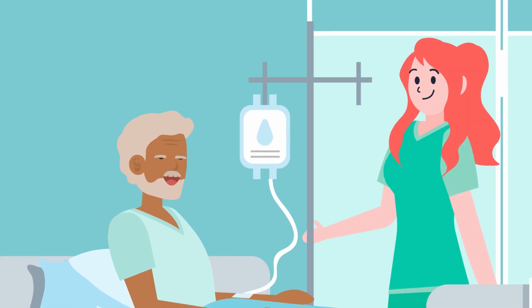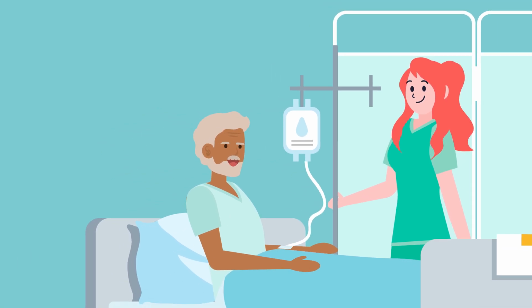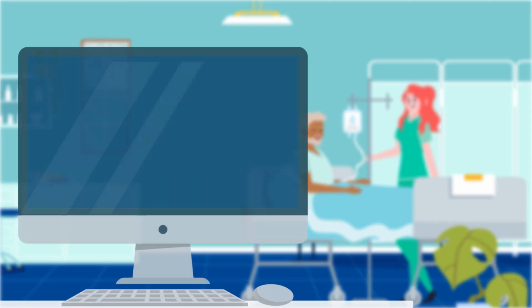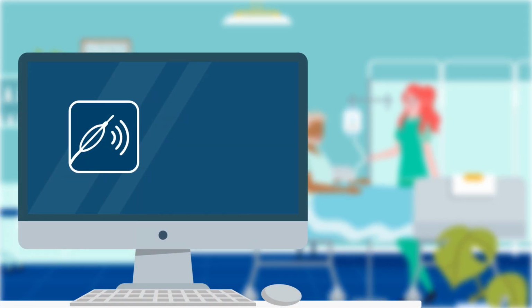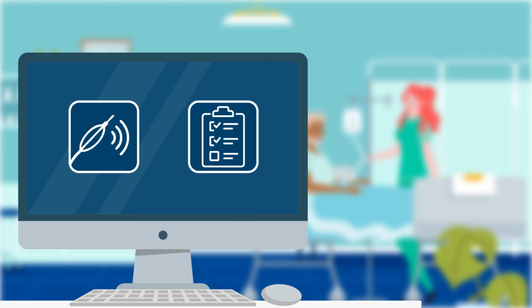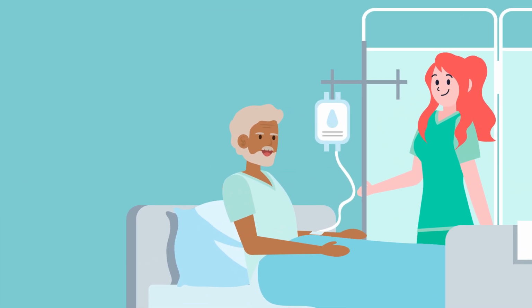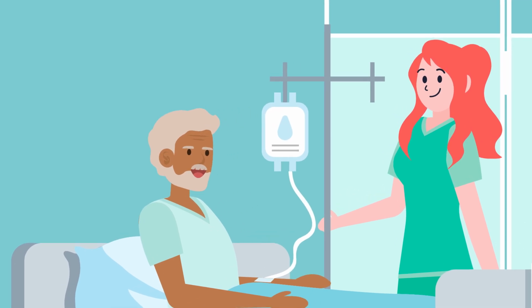RAVE is deliberately pragmatic. Randomization is performed before the procedure takes place. The patient is allocated to one of two arms, IVL treatment or no IVL treatment. Once the lesion is crossed, the allocation is revealed to the operator performing the procedure.